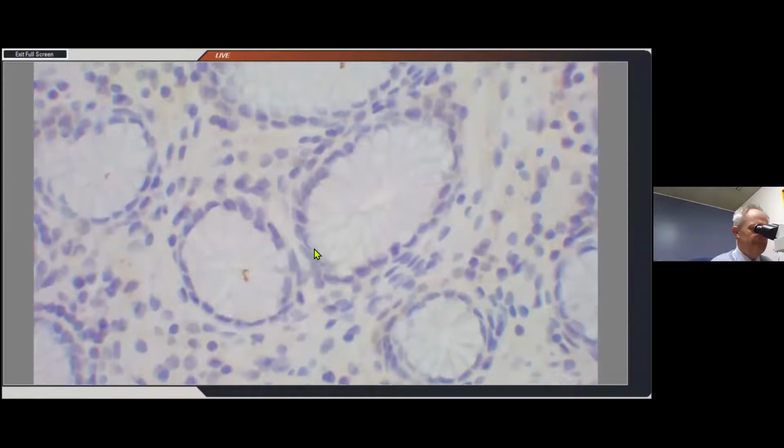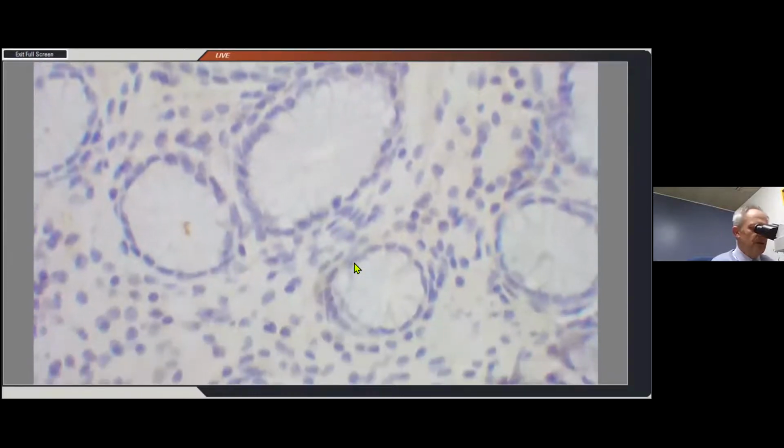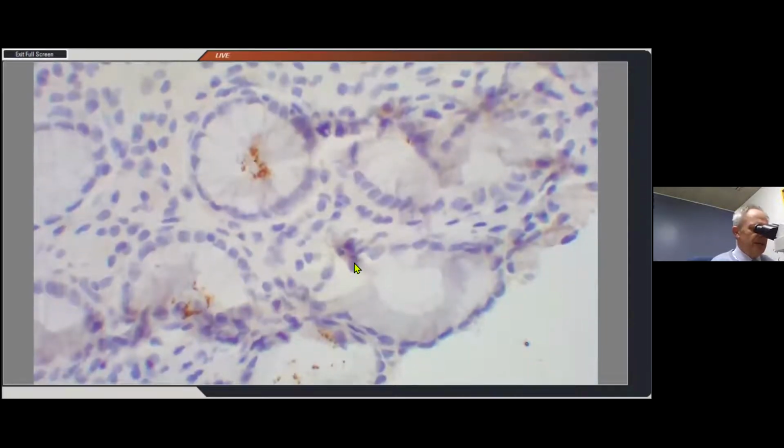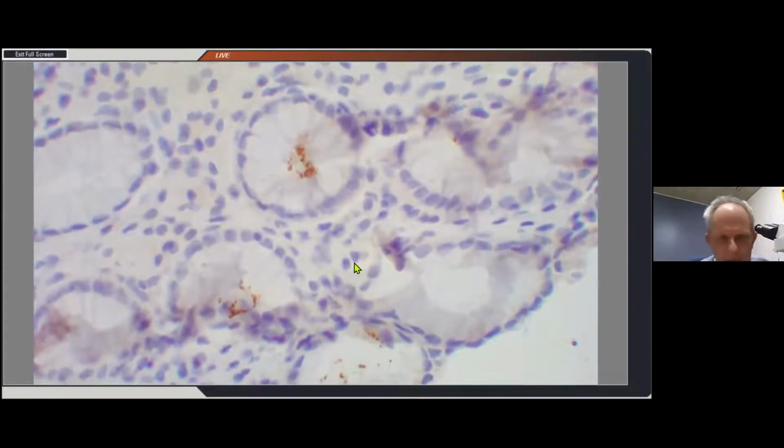And if we look here, in the crypts, just wait for the picture to build, you can see there, okay, a curvilinear structure, which is consistent with Helicobacter pylori. And the problem is, as I said, often special stains make the problem a different color. And if you look at this here, you can see, for example, there, that I think there are a couple of bacteria there and there. But this here, I think, is artifactual staining, but probably just contamination.